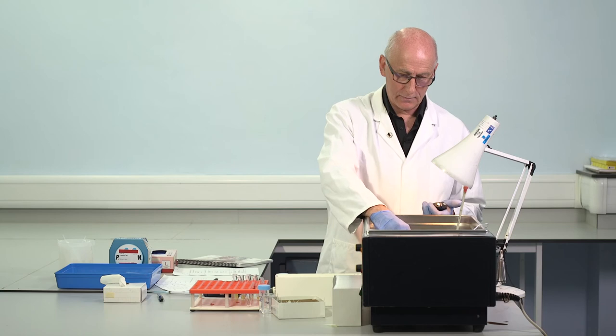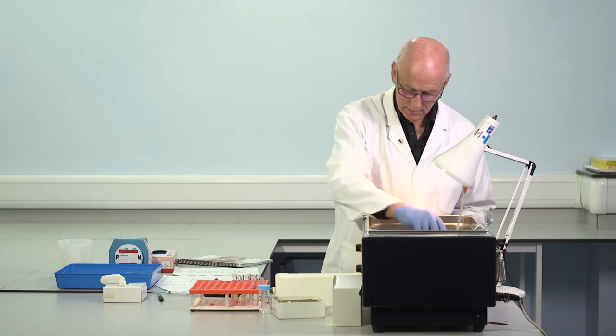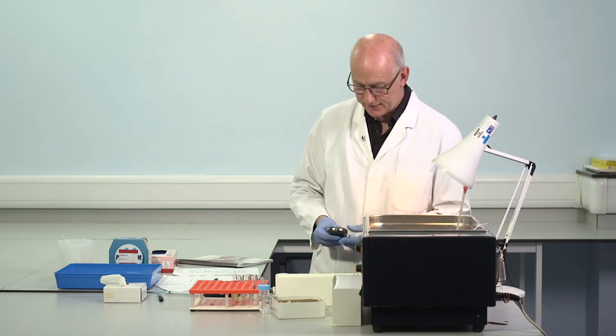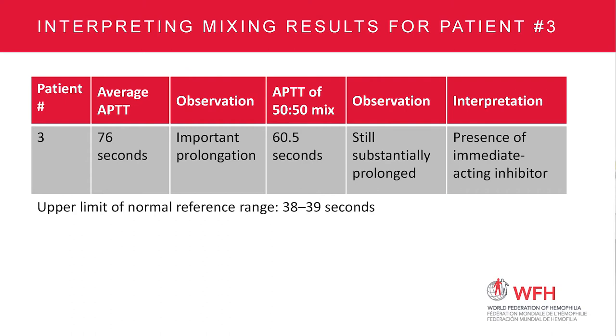So the first duplicate's clotted. And the second. So we've got 59 seconds and 62 seconds. 59, 62. Patient number 3. The APTT on the patient sample, 76. On this equal volume mixture, 59, 62, around 60 seconds. So it's a little bit shorter, 10 seconds shorter, but it's still substantially prolonged, substantially. Upper limit of normal, 39. Grossly prolonged. So for sure, we have an inhibitor present in this sample.